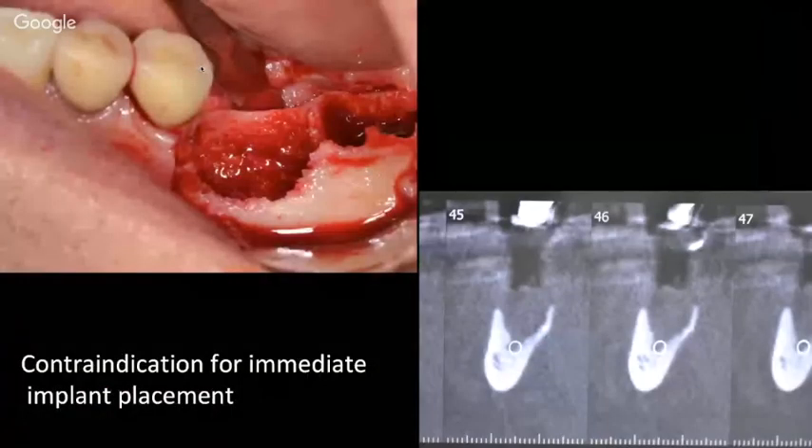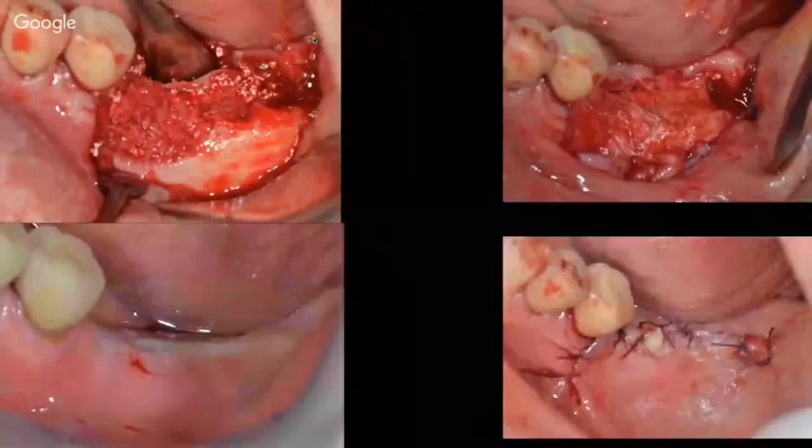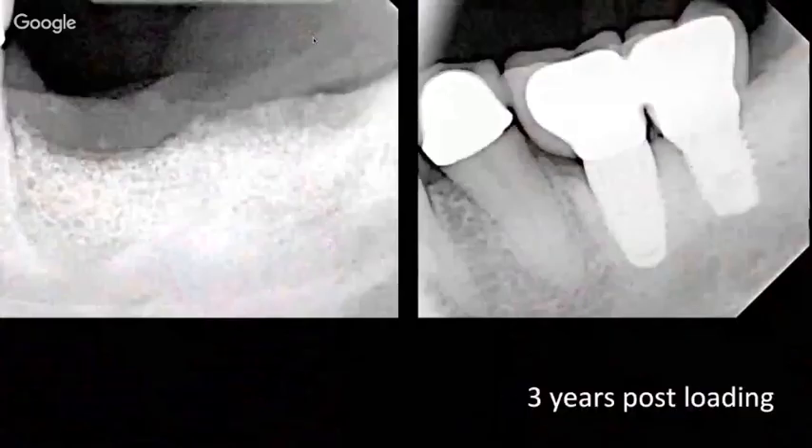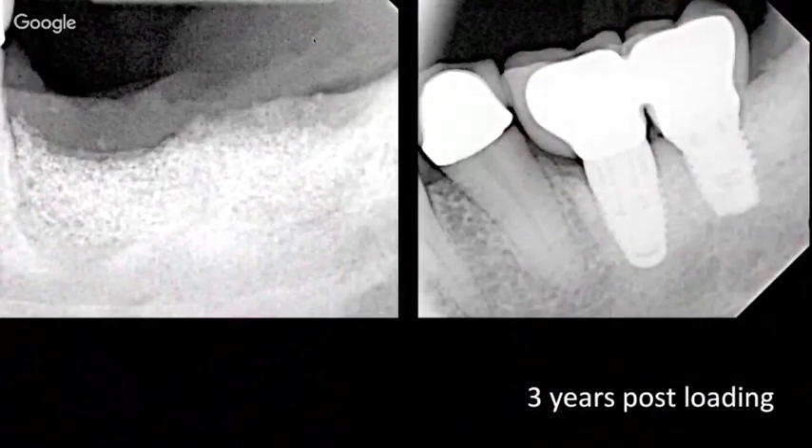There are situations where immediate implant placement in the molar site is no longer indicated — particularly where we have literally no bone left. Here you can see the nerve flush with the apical part of the extraction site, so this is not an indication for immediate implant placement. In that case, we need to graft the socket using autogenous bone, a substitute, or calcium sulfate, cover with a membrane depending on the defect, then close and wait approximately four months before placing the implant in a proper position. Here is the situation three years follow-up.